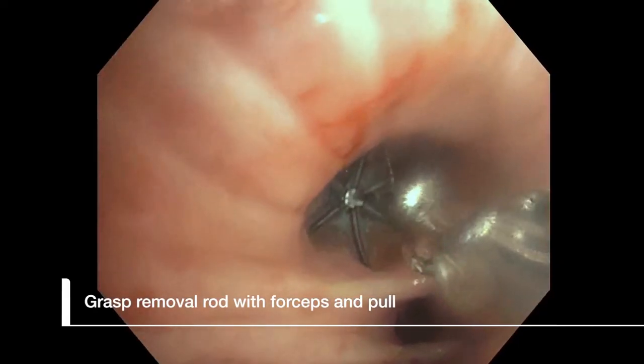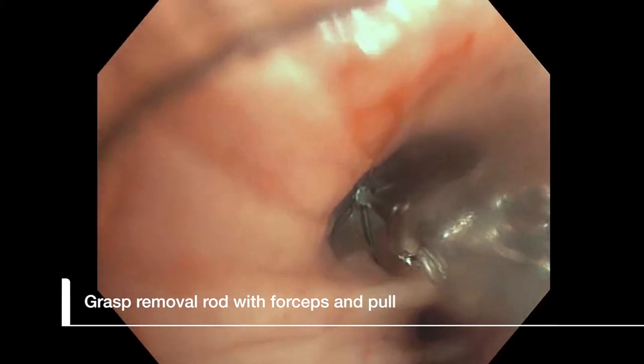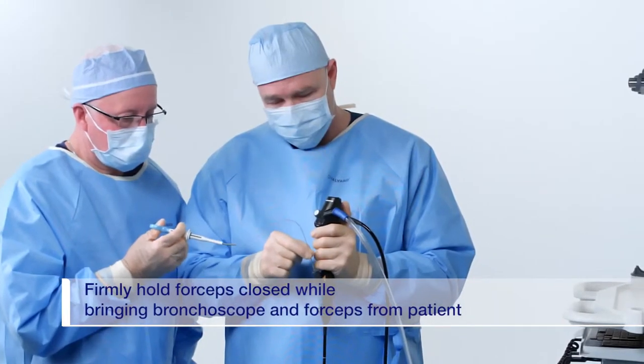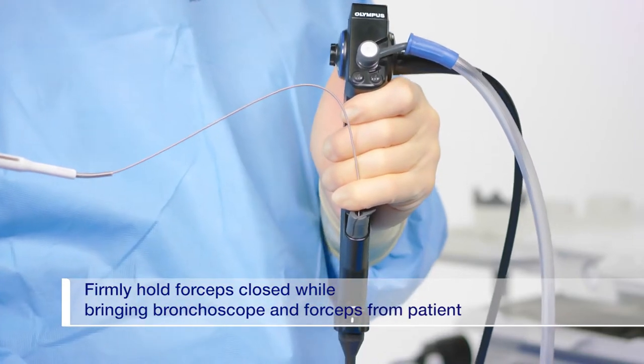Grasp the removal rod tip with the appropriate forceps and gently pull the valve until it is dislodged from the airway wall. While still firmly holding onto the valve with the forceps, simultaneously remove the bronchoscope and the forceps from the patient.